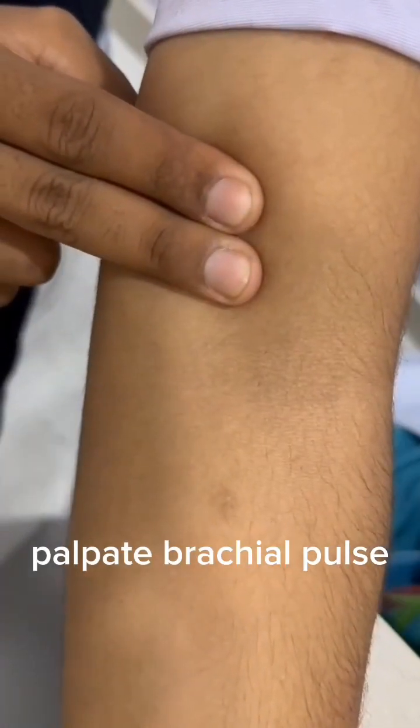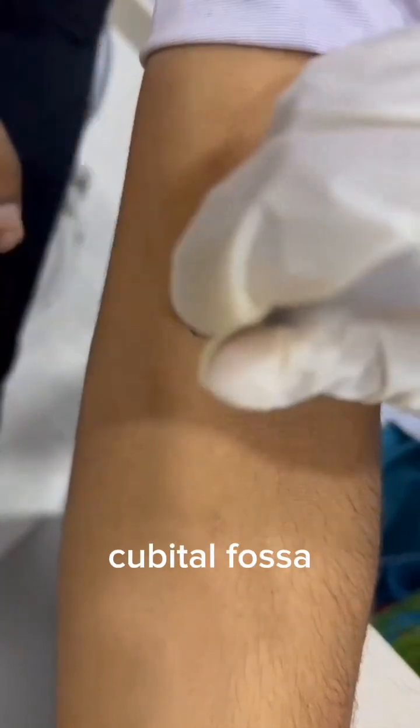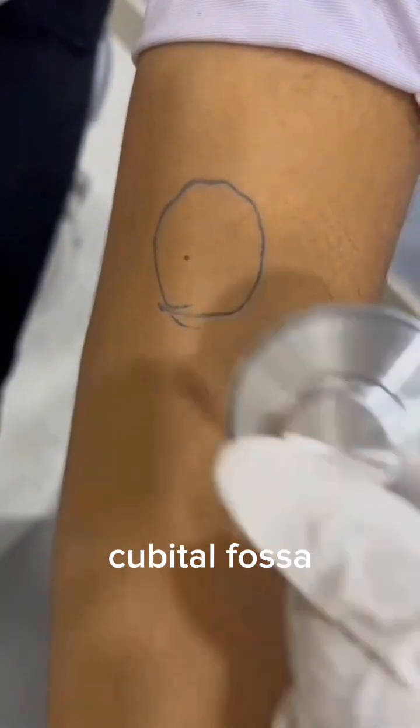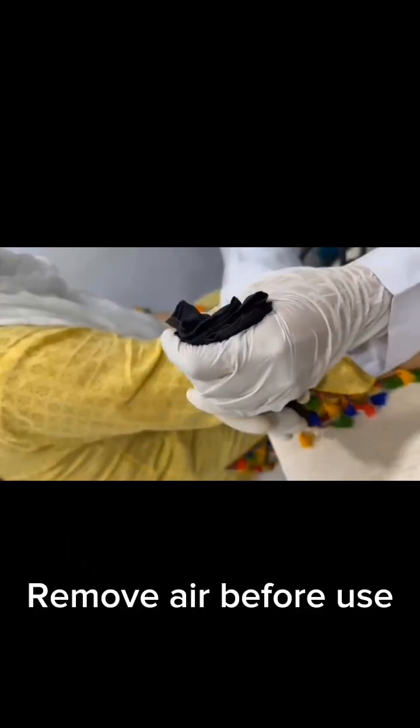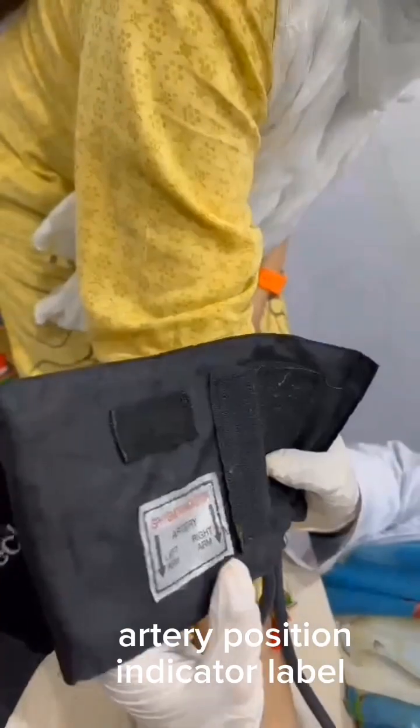Today I'm going to discuss how to take the pulse rate. Palpate the brachial pulse on the cubital fossa with two fingers. Always remove air from the blood pressure bladder present within the cuff before the use.